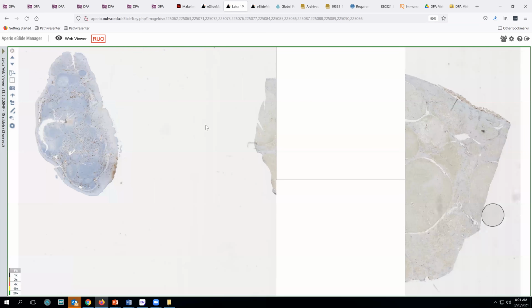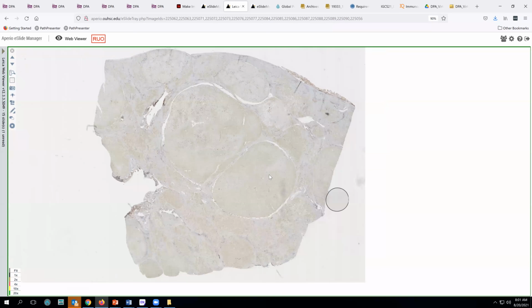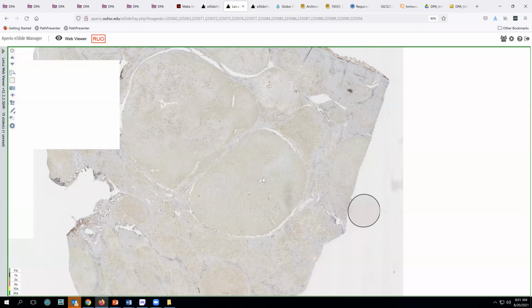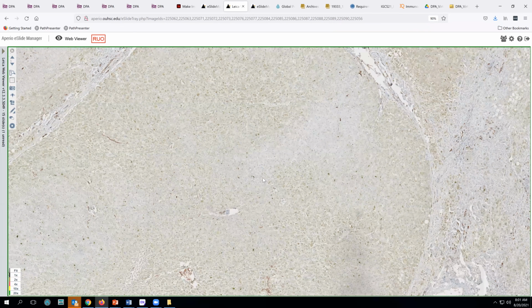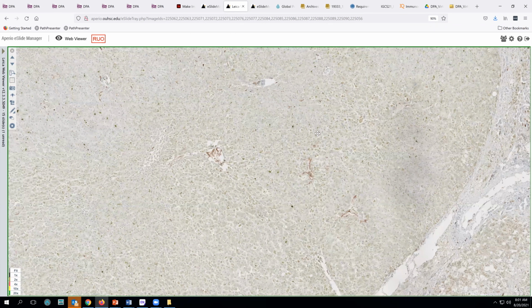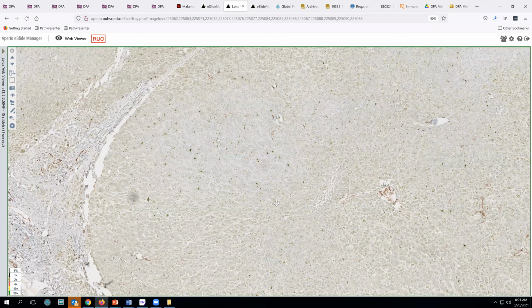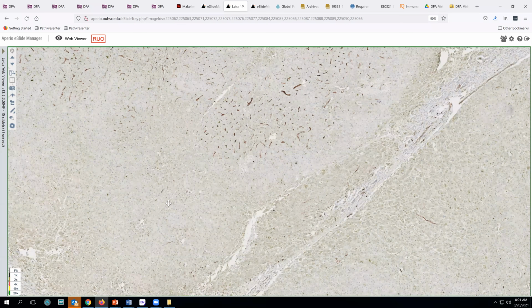I think one, oh dear, this did not light up really well. There we go. All right, so one of the things that I did to help to highlight this, and it looks as though I have the wrong stain here. Well, so one of the things that, oh, here we go.